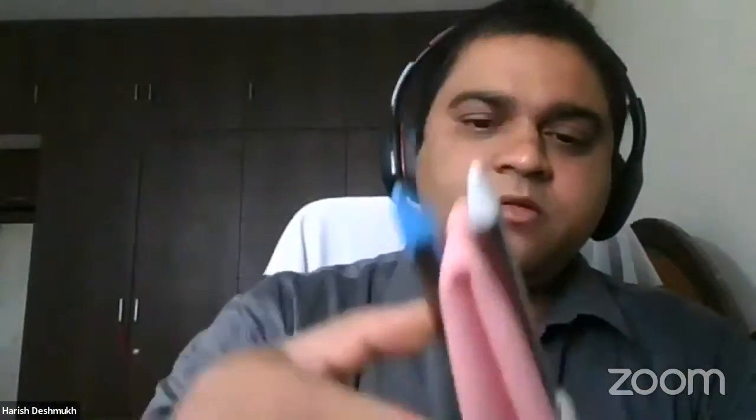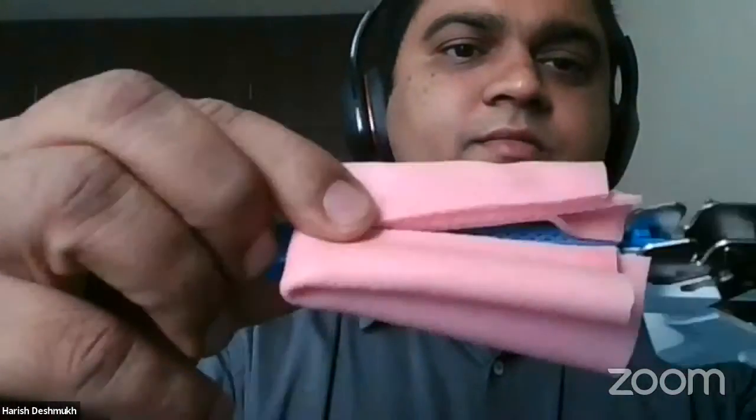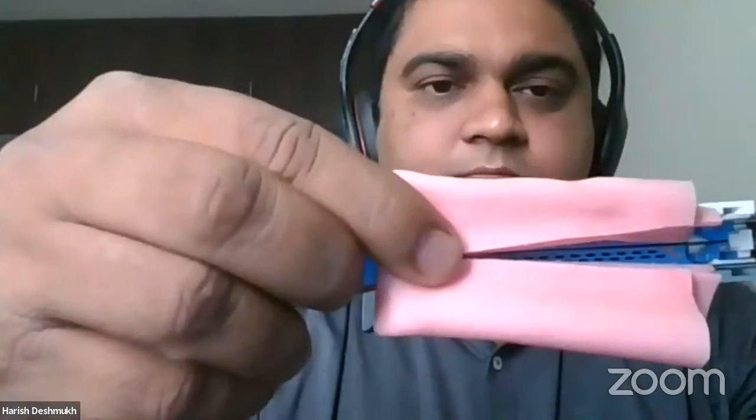It will show us only the cut line, sir, because there are no staples in it. So come back to the original position. If you see here, we have only the cut line here. We don't have staples in this, because of which it is showing only the cut line in the center. So this is the point. You can see only the cut line.